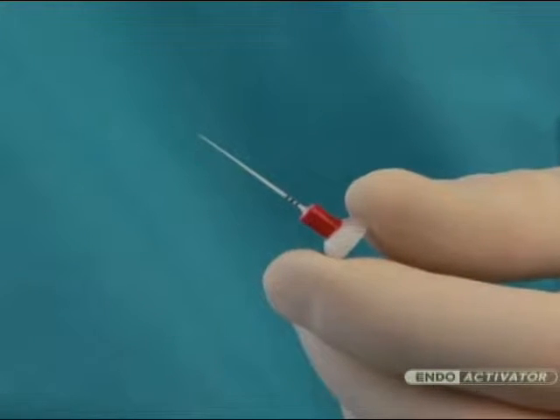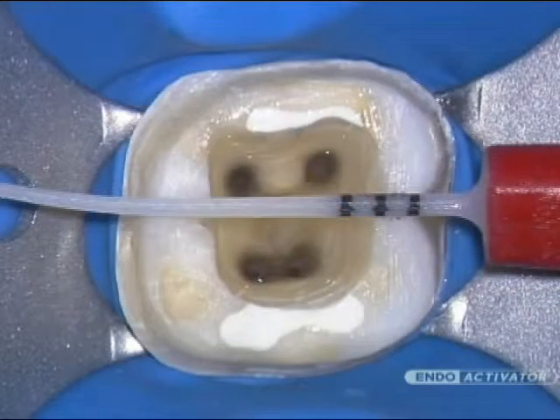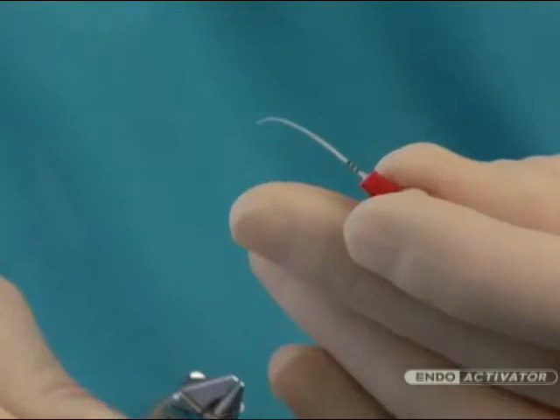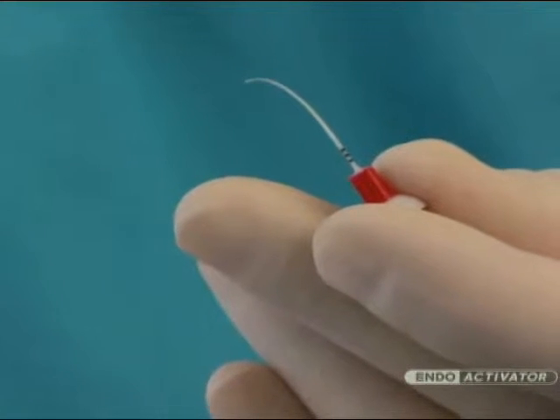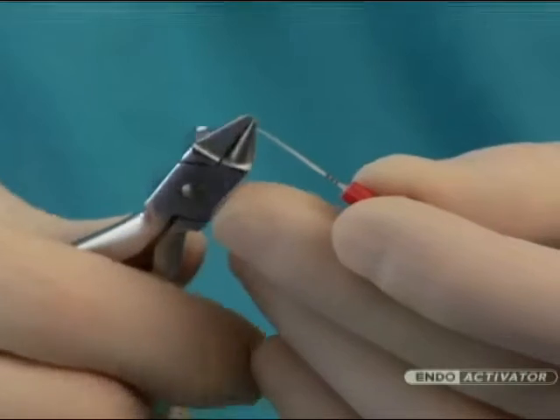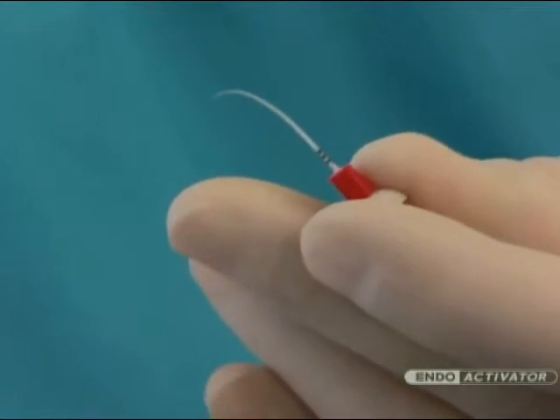The bowl-shaped clean guard serves to consolidate the protective barrier, and orientational depth gauge rings are positioned at 18, 19, and 20 millimeters. At times, it may be helpful to pre-curve an EndoActivator tip to facilitate placement. In these instances, orthodontic bird beak pliers can be used to place a smooth curve.